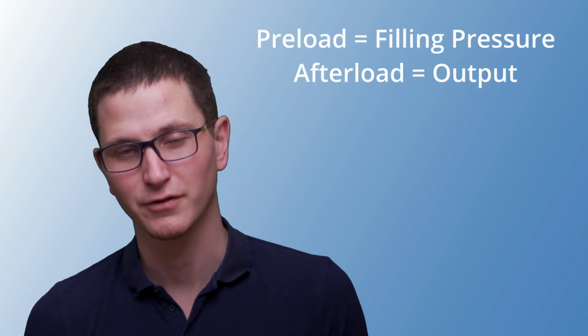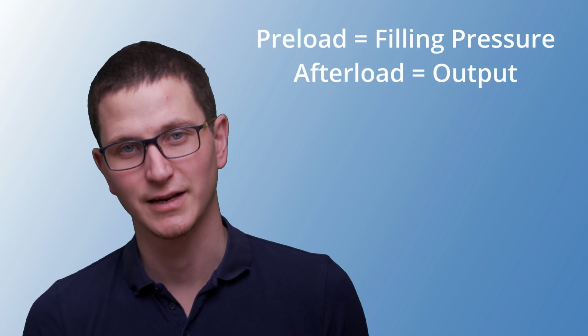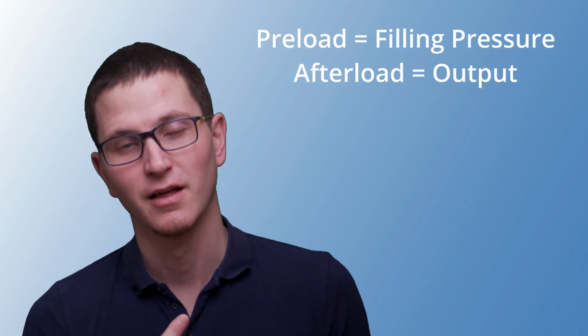Why would we want to shock pulseless VT, right? VT stands for ventricular tachycardia, which just means that the ventricles are firing too fast, right? And so we are now not generating any forward flow. The heart isn't doing what it's supposed to do. Do we want to stop this? Yes. Why? Well, because the ventricles are firing so fast that there isn't enough time for the ventricle to fill up and then get the blood out, right? So your preload and your afterload are all messed up because there isn't enough time for filling of that ventricle.